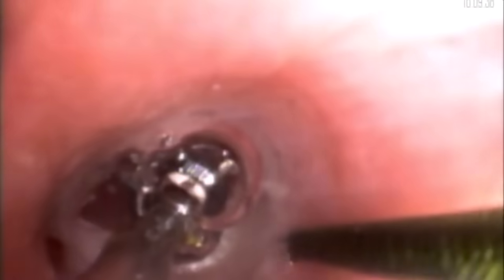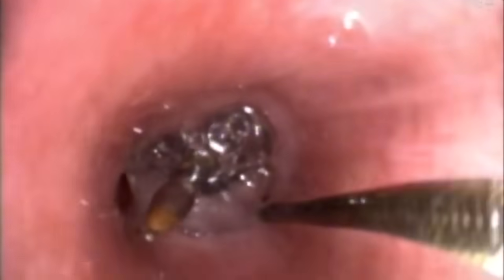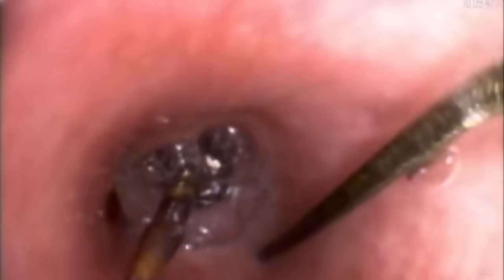We tried to gently push the retrieval basket beyond the pin so that we could snare it and remove it. As you can see from the video, we were unable to successfully advance the basket beyond the pin despite multiple attempts.